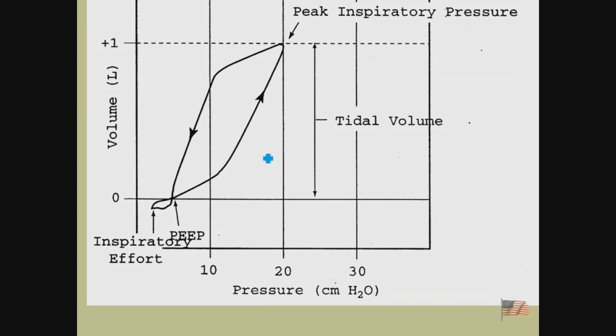And that's basically what we were just talking about. That's the level of PEEP. That's the inspiratory effort, inspiratory phase, expiratory phase. The tidal volume being delivered is the height of that.